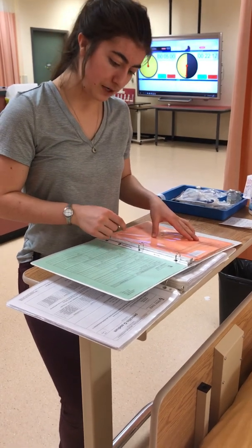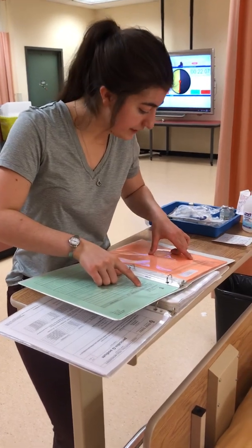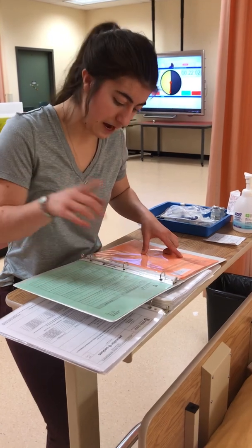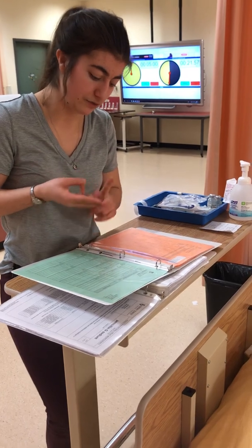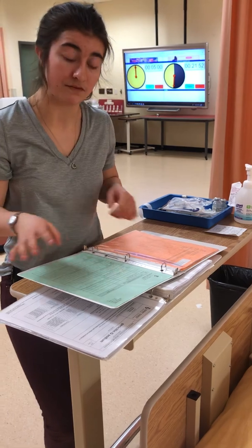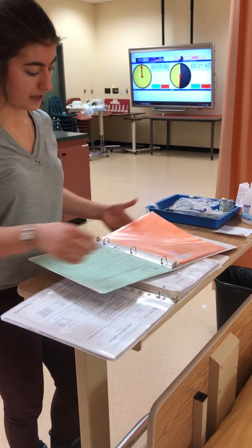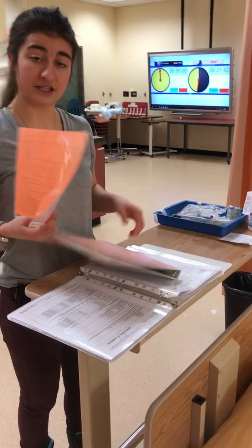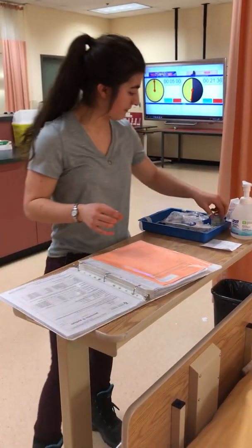So the medication I'm going to be giving today, knowing that I already have the correct patient, the correct drug, is penicillin G sodium. That's good for both of them. 3 million units I have on both of them. This is going to be an IV medication, so I have the correct drug, correct dose, correct route, and the same time is the correct time. They want it every 4 hours via mini bag, and that matches on both of them. So I am going to put the physician's order away because I've already reviewed it. It's good to go. Now I'm just going to be grabbing my medications.